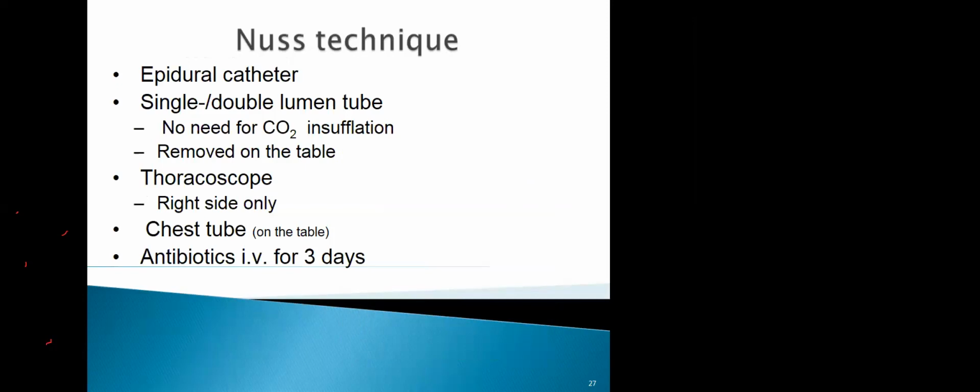I'm going to talk about Nuss a little bit more because that's what I usually recommend to my patients. But if you have any questions, we can go through the Ravitch procedure stepwise. And there is a video of a Nuss procedure which we sort of modified. I will share it with you.